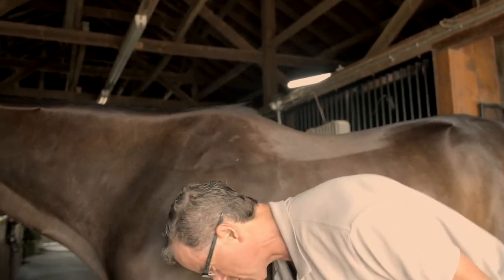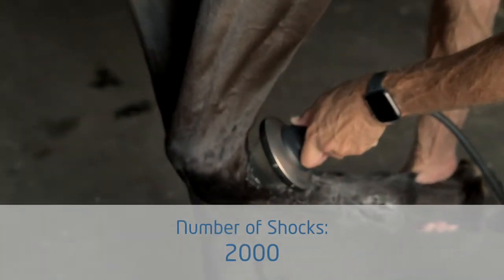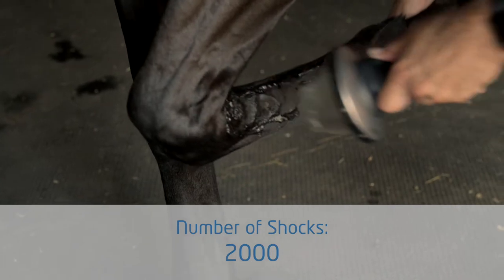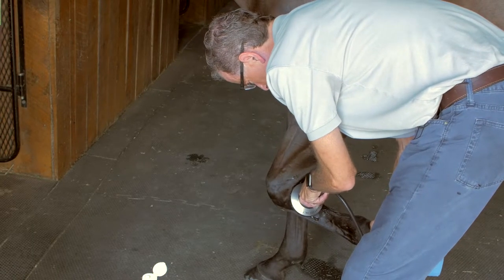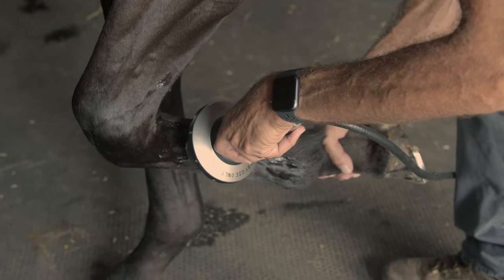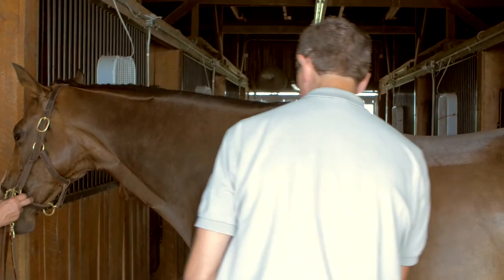This can be a little cumbersome sometimes — I'll have my assistant keep the leg up — but with the leg flexed just a little bit, you can get right into the insertion. You don't want it flexed so much that you can't get the probe in; just down a little bit like this. You get nice contact and you can see how it fits in beautifully. I'm slowly moving distal on the leg.